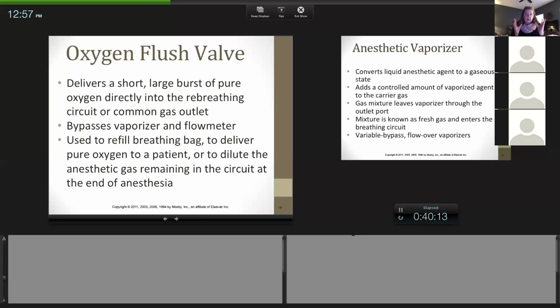Because you guys get spoiled at school. The machines at school, everything's labeled and everything's laid out very nice and very pretty. Some of you are going to go into clinics that have maybe very old machines. They all have the same parts and they all work the same way, okay? It's just maybe set up differently. But I tell my students this all the time: it would make me very uncomfortable to be thrown into surgery when I've never looked at that machine.